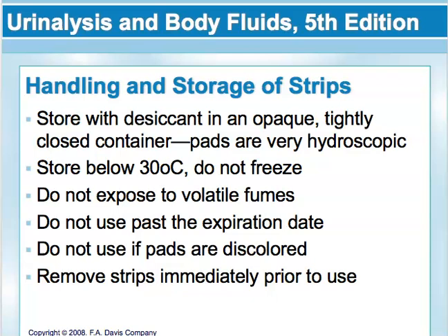So say you've got a urine that needs a urinalysis, but you're expecting another one to come from the ER in just a minute. Don't go ahead and take that reagent strip out and leave it sitting there while you're waiting on that next urine to come over. Only take those strips out of the package right before you're ready to start the testing, and then reseal that bottle as soon as you've removed that strip.